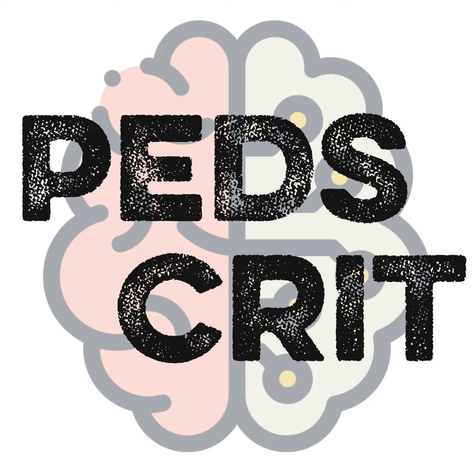So you're never asking the question of like, is PEEP of 16 good or bad? Okay, of course it's bad. Would I rather be on a PEEP of 10 or 16 if my kid was into it? No, it's PEEP of 10, obviously, right? But if your kid needs a PEEP of 16, the question you're really asking is, is my kid better off on a PEEP of 16 or are they better off on APRV or the oscillator? And so you're always comparing against what your risk benefit of different things are.